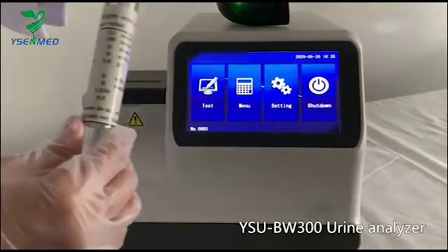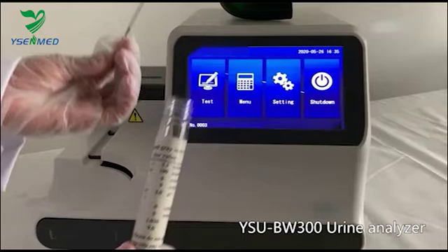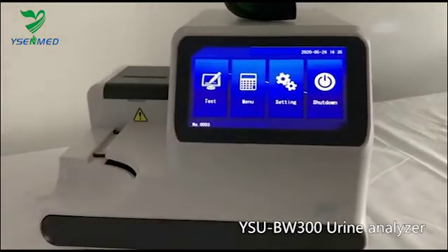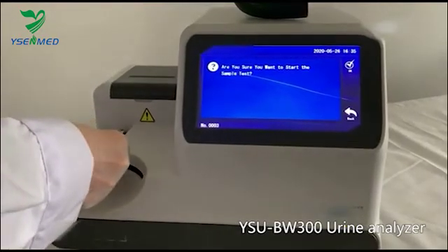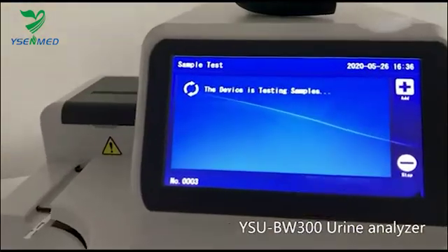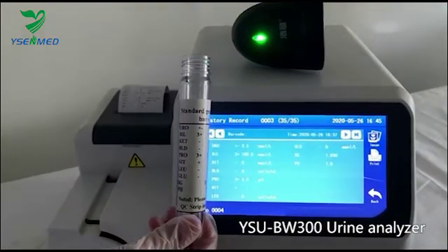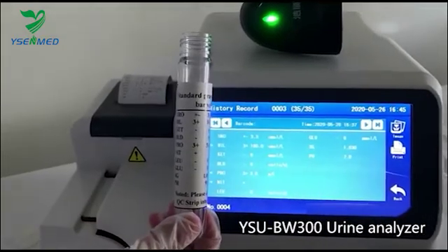Every set of BW300 has a calibration strip. It is packed in a transparent plastic bottle just like this. Click Test. Put the calibration strip on the conveyor. Compare the result on screen and the label in the bottle, where it has a standard value.